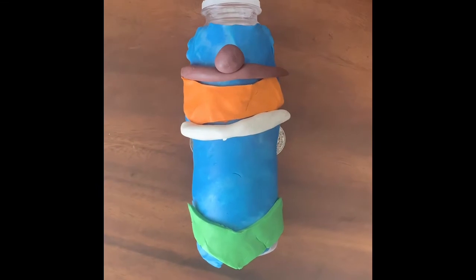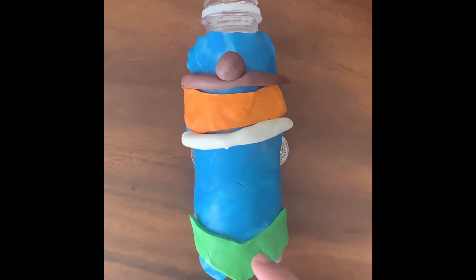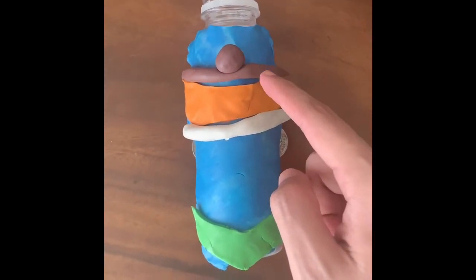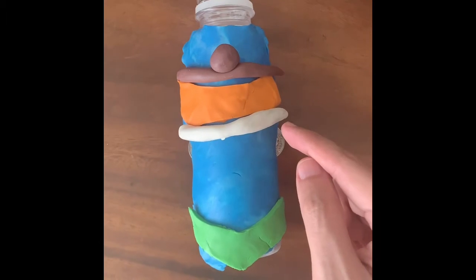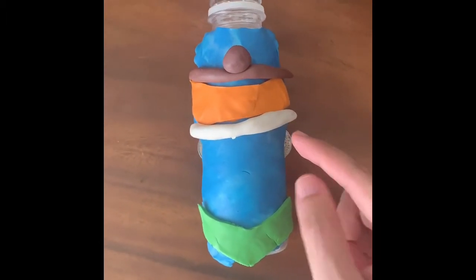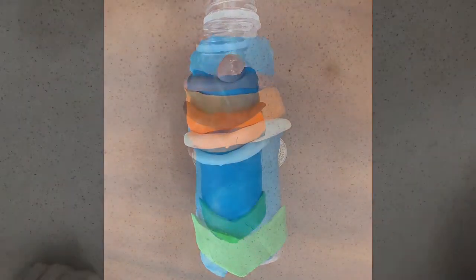So for the surface landmarks, run your finger up the midline of the neck, starting inferiorly at the sternal notch. Identify the thyroid prominence or Adam's apple, and moving inferiorly, the finger slips into the depression of the cricothyroid membrane, followed by the solid prominence of the cricoid cartilage. The incision should be placed 1 finger breadth below the cricoid prominence or 2 finger breadths above the sternal notch.